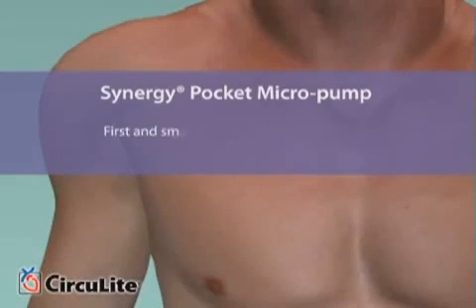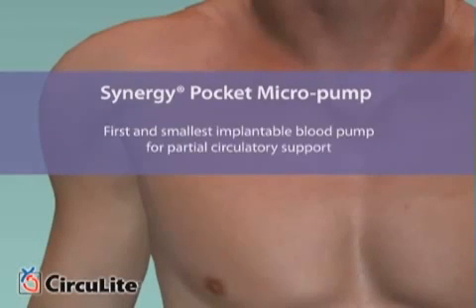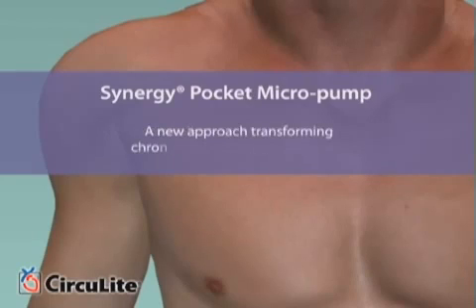The Synergy Pocket Micropump is the world's first and smallest implantable blood pump for partial circulatory support, a new approach that is transforming chronic heart failure management for patients with New York Heart Association Class 3B or early Class 4 heart failure.